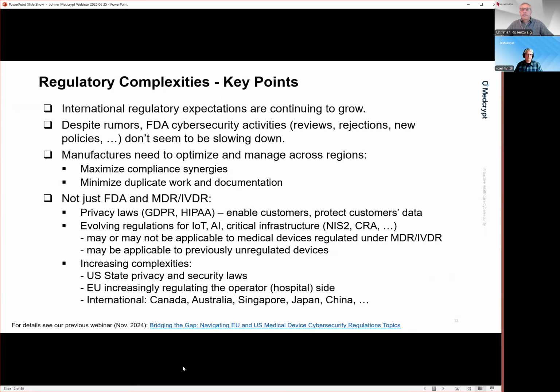Yeah, next slide, please. All markets have some regulatory challenges. So we observed that the regulatory expectations are growing. FDA and also notified bodies in Europe do not slow down. In contrary, we see more and more critical questions and findings in audits at our customers. For the manufacturers, the challenge is to streamline their activities to be competitive, and thus they have to look for effective processes for cybersecurity, considering all market requirements.